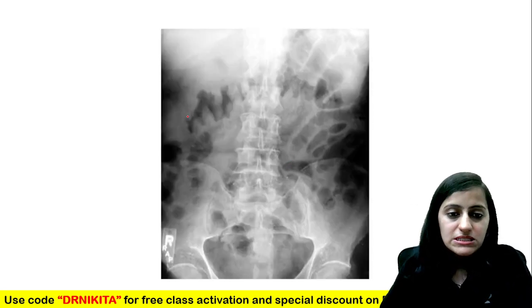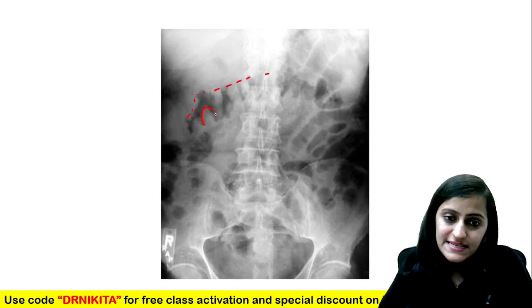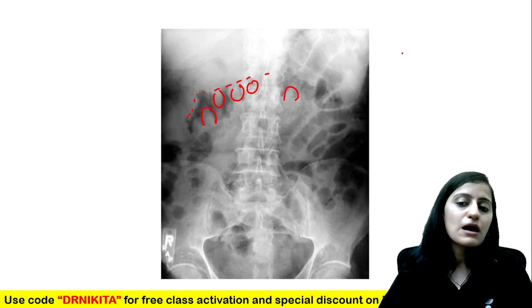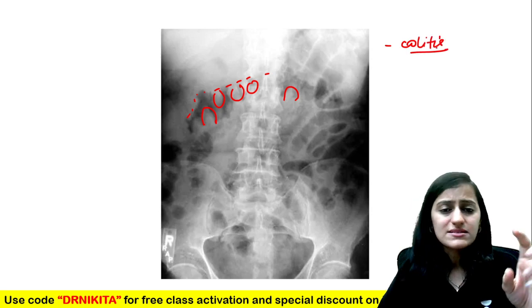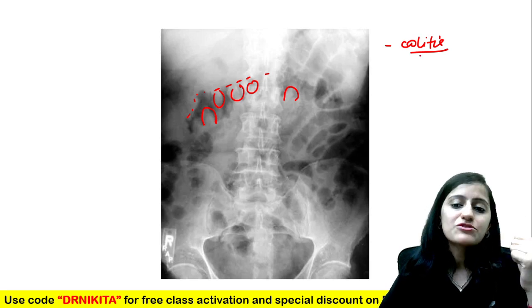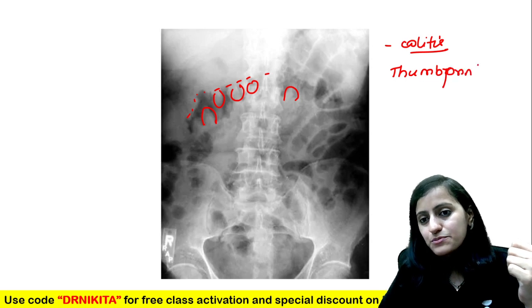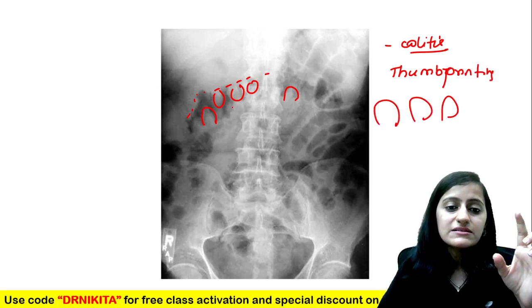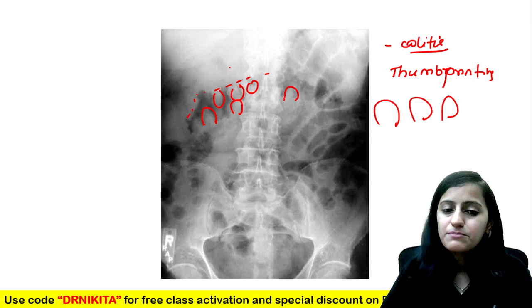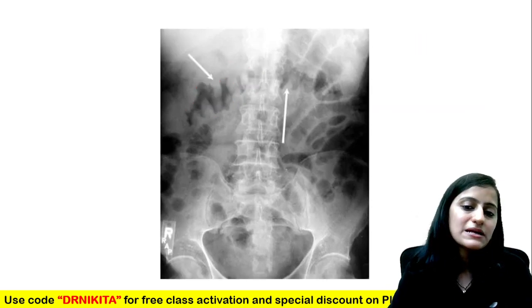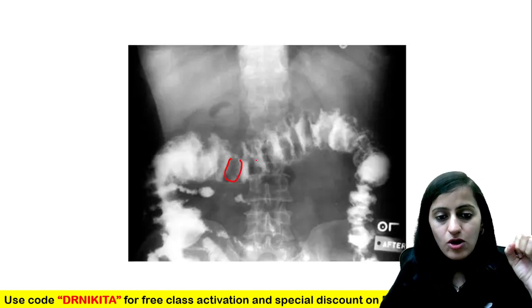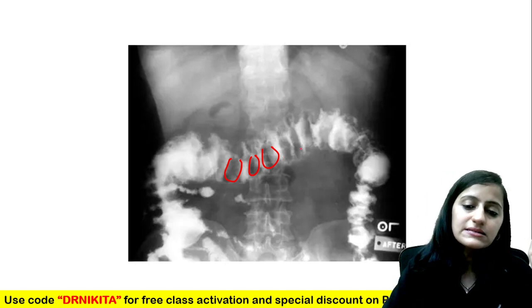In this patient we see the transverse colon with thickened, edematous haustrations — this is edema of the bowel wall, which might be seen in any colitis: ischemic colitis, pseudomembranous colitis, or inflammatory bowel disease. This appearance is called thumbprinting, because of the thickened haustrations. Thumbprinting can be seen in all types of colitis. When we do a barium enema in such a patient, we again see the thickened haustrations.